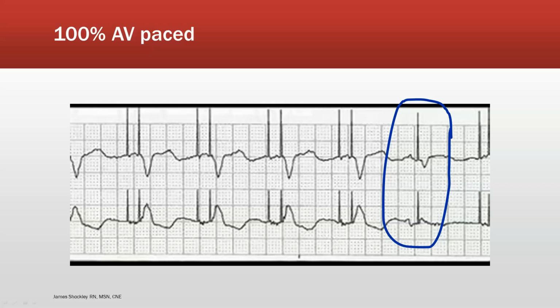But what I do see is that this is kind of that demand pace. So here it waited until you had a P wave, it waited, and nothing came. Okay, now I'll initiate a signal, and you have your PRI, then it waited. Okay, I don't see anything happening from the ventricles, so we're going to give it a shot, and then you have ventricular contraction. Whereas over here, it said, okay, I do sense something coming from the atria. However, the ventricles aren't responding, so I'm going to set a pacer spike in front of that QRS.